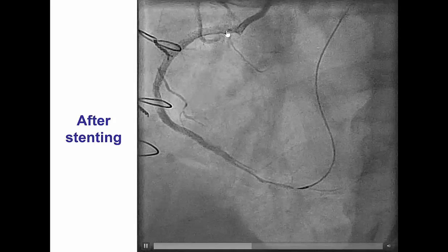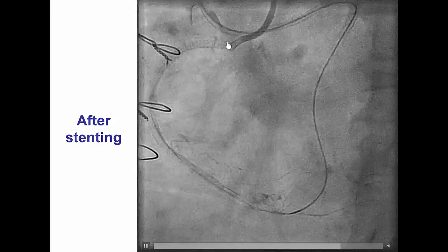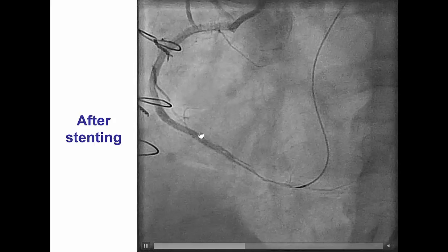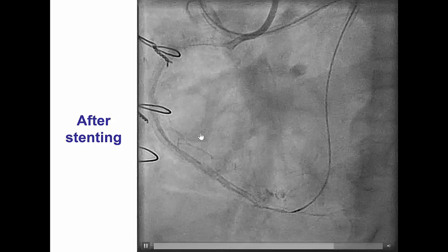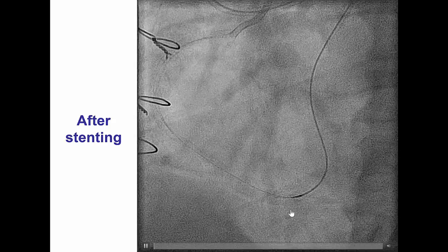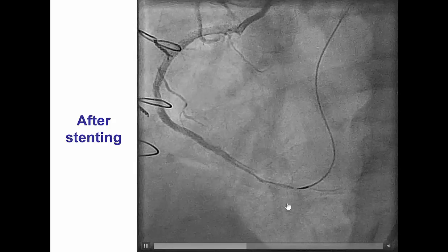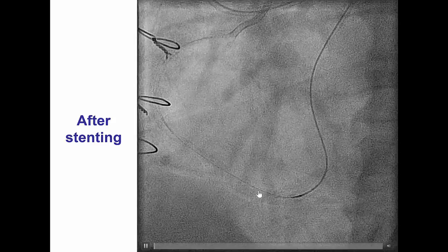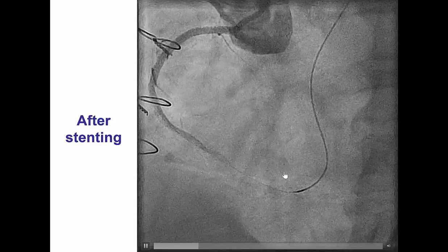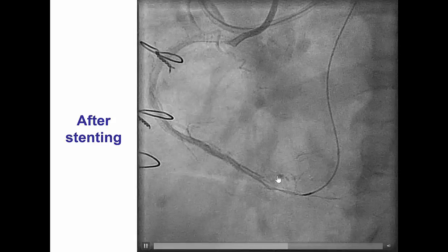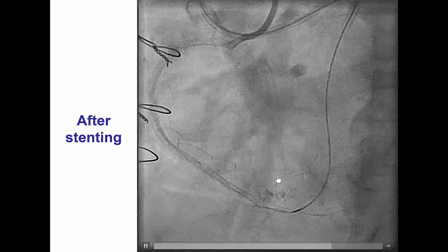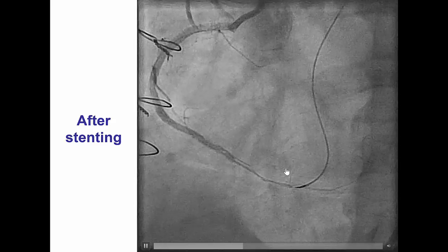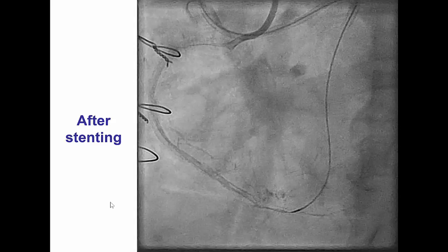After doing that, we placed several stents all the way from the proximal right coronary artery to the posterior descending artery. However, after doing this, we saw that we had a perforation in one of the small branches of the posterior descending artery, which was likely the result of that antegrade guide wire that had entered into a side branch.